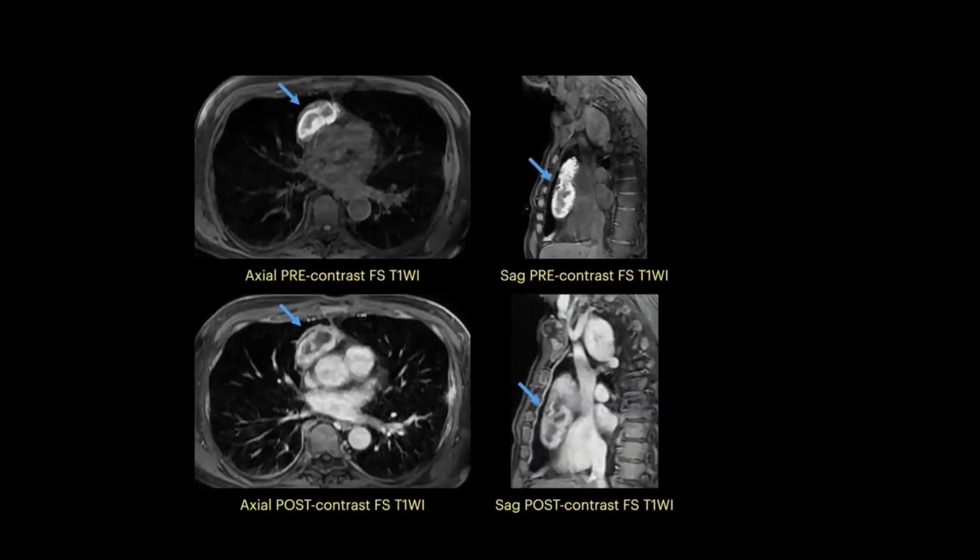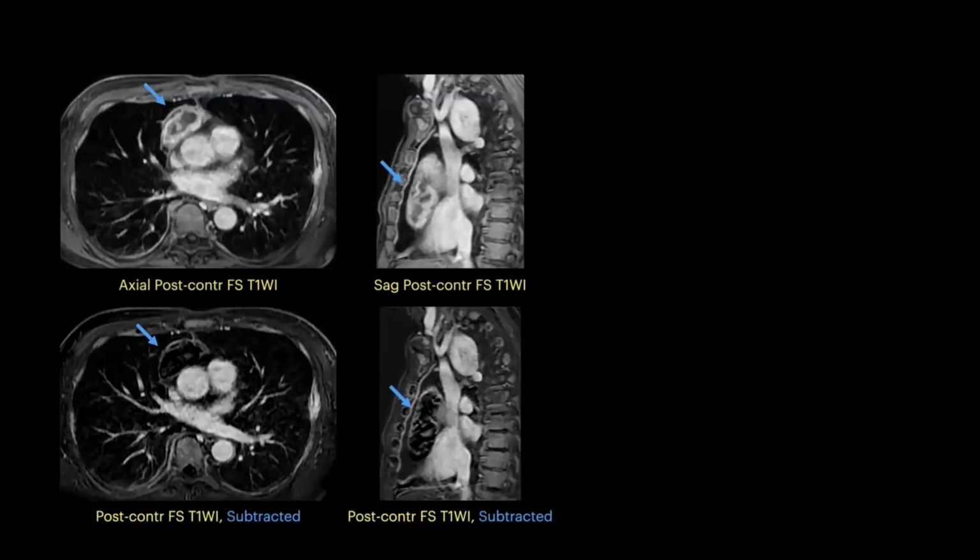Pre and post contrast images show, well, what do they show? Is a lesion enhancing or not? Even on MR, it can be tough if a lesion is intrinsically T1 hyperintense. But we can put ROIs on the lesion to look for enhancement. But better yet, we can get automated post-process subtracted images.